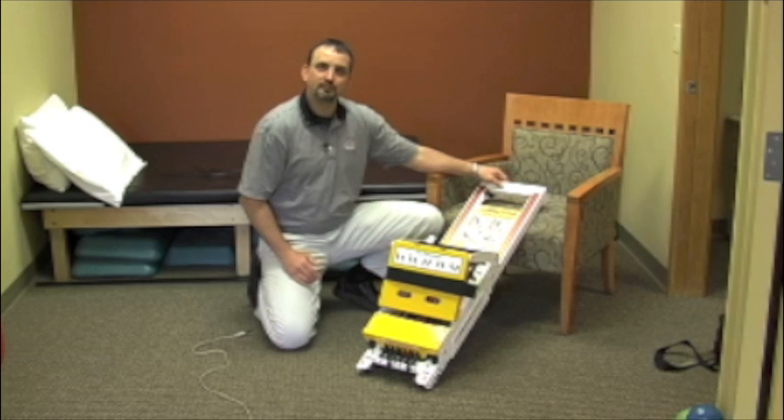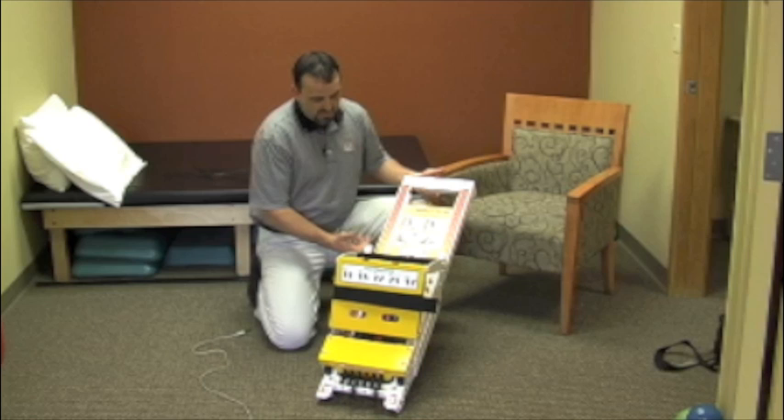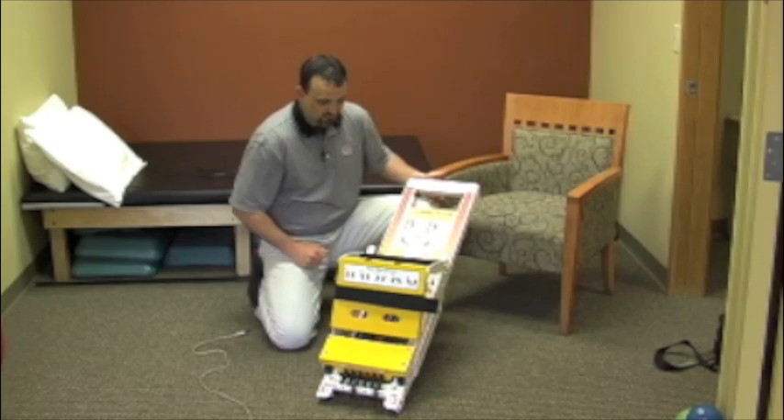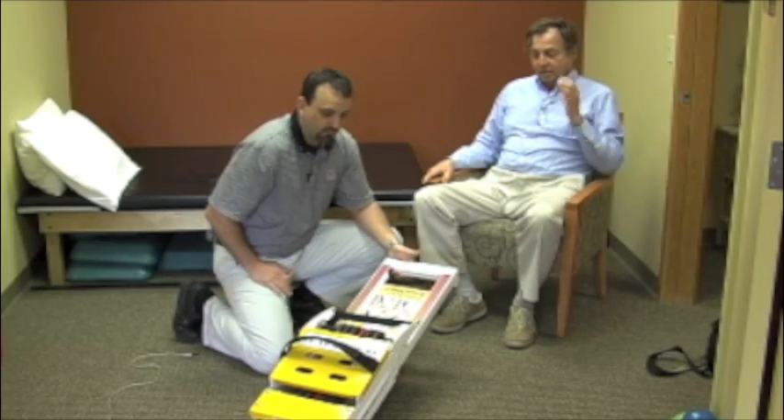Another nice feature about the Mini Press from a documentation standpoint — it has scaled pieces on here so you can actually look at different aspects of documentation. I brought somebody in to help me demonstrate the versatility of the Mini Press.